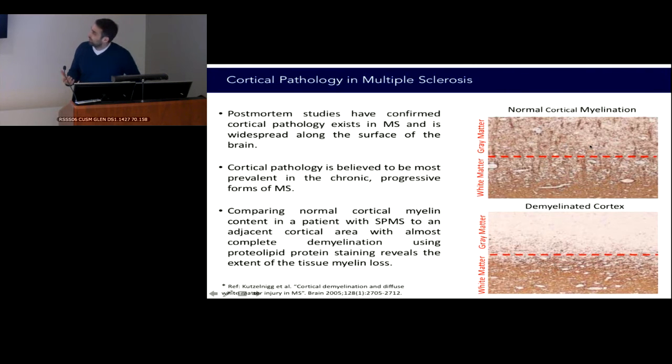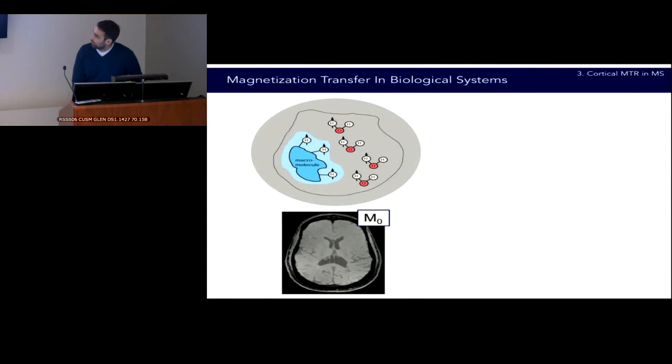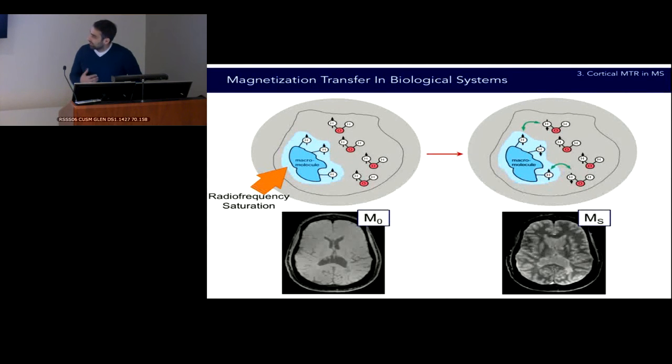So the real question of this study was, could we use MRI, in this case at 3T, to identify spatial areas of the cortex where this demyelination is occurring and to try to quantify it. And for this purpose, we used a technique known as magnetization transfer imaging, which Eve here has pioneered many great methods for. We used, in this case, simple magnetization transfer ratio imaging.